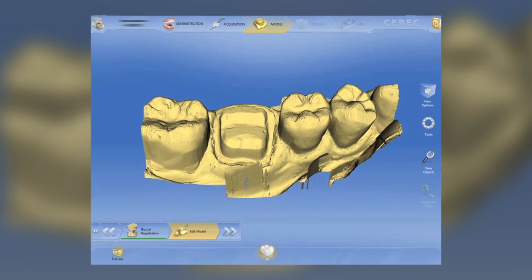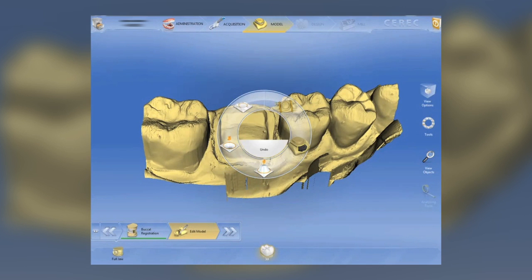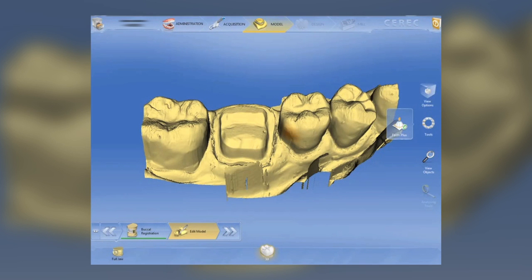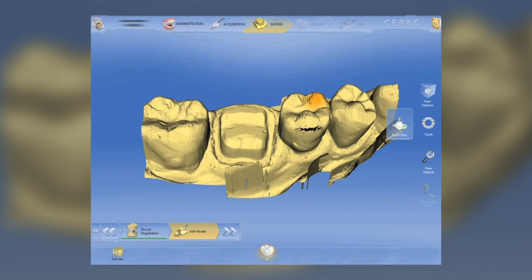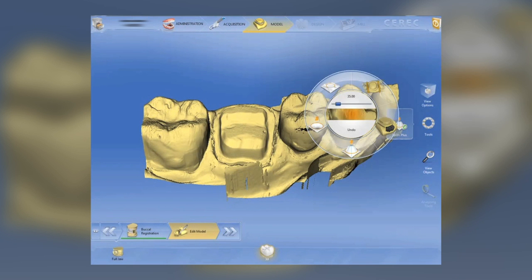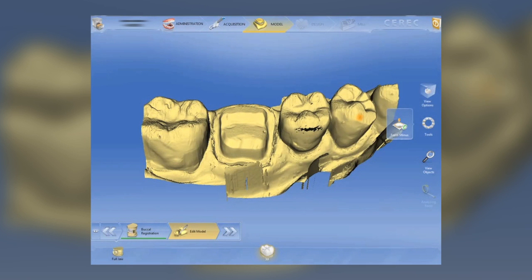One of the nice features is the ability to modify our models. In the past we had the feature called correct optical impression, but this 4.0 software takes it one step further — we can actually add or subtract to our working model. Here you can see I'm using the form plus tool to add to the model, not just the preparation but also the adjacent teeth and the opposing teeth. You can raise a cusp, you can lower a cusp. If there are defects in the model, you can simply adjust those defects ahead of doing any design work.